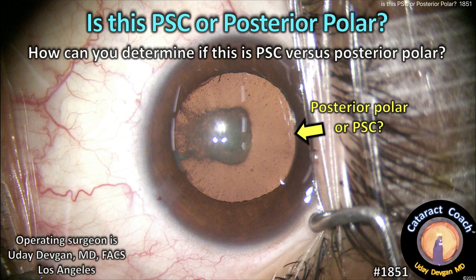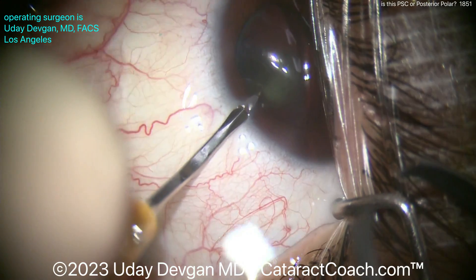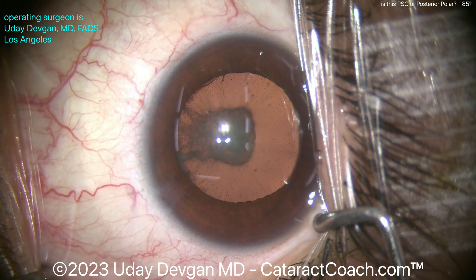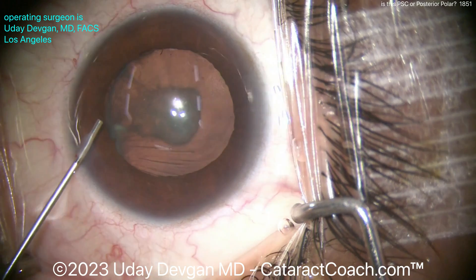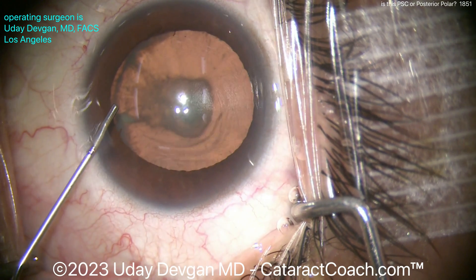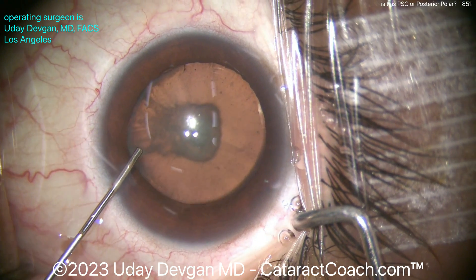Is this posterior subcapsular or posterior polar cataract, and how can you figure it out? It makes a big difference in the way you do the surgery. Starting off, you see there's that big central opacity on the posterior surface of the lens. The really dark central part kind of looks like posterior polar, while the rest, more diffuse and spread out, maybe looks more like posterior subcapsular. So how can you tell?